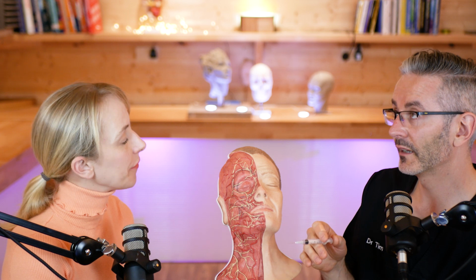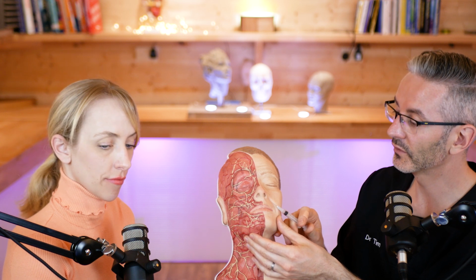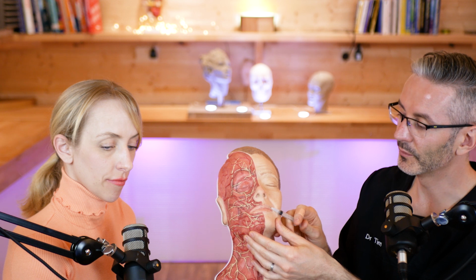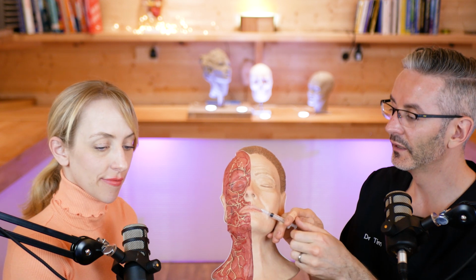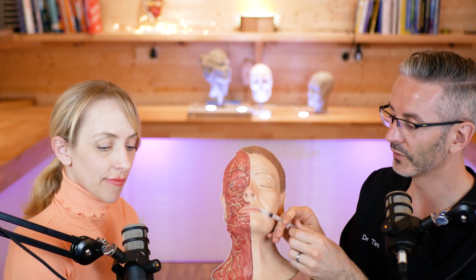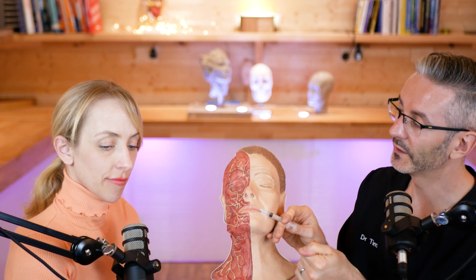The next thing I'll just say about aspirating before we move on is there's nothing to stop you aspirating more than once. And I certainly do this in more high-risk areas. So maybe if you're doing the vermilion border over here, you know that the superior labial artery runs up in that area, and you've had an occlusion there in the past. We did this recently for the complications program with someone who had an occlusion there. We went through how you can chip away at that risk even more.